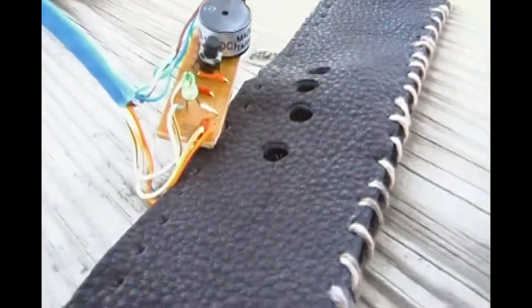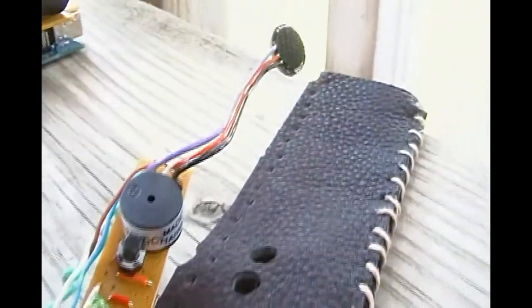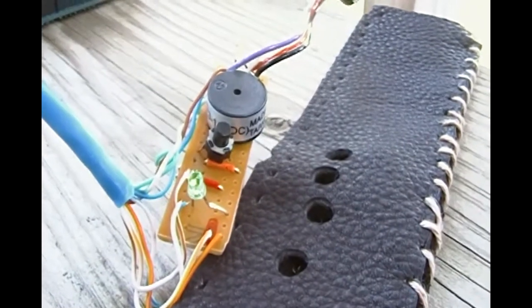Here we have the part that will go on your wrist, which is the heartbeat monitor, the pulse sensor, the temperature sensor, and the actual leather bracelet.